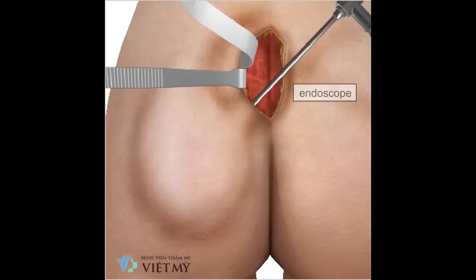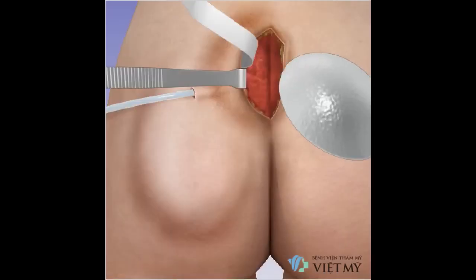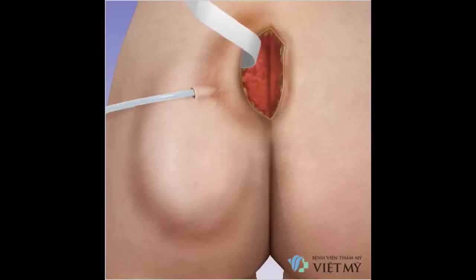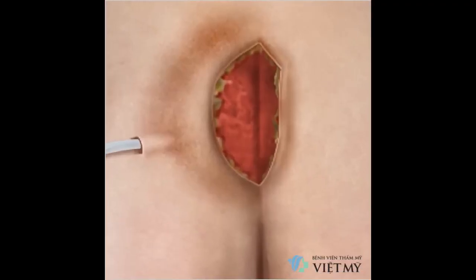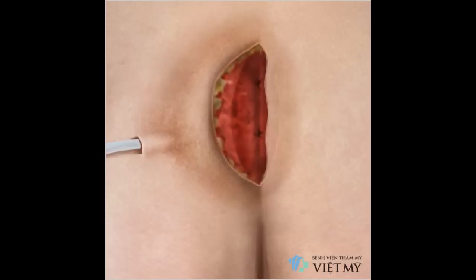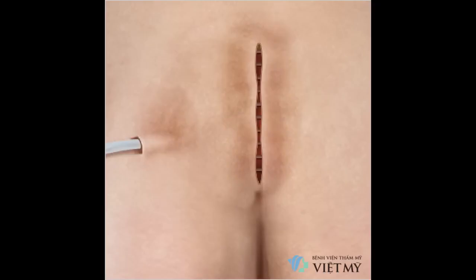Your physician may use an endoscope or fiber optic retractor to check for complete dissection. A drain, which allows fluid to exit your body as you heal, is put in place and the pocket is cleansed. Your physician will insert and carefully position a sterile implant, ensuring a tension-free fit inside the muscle. Once both implants are in place, your physician will verify that they look natural and symmetric. The openings to the pockets for each implant are sutured with dissolvable stitches. The openings used to access the sides of the buttocks under the skin are then sutured to the midline, and the incision in the intragluteal crease is closed. This incision may be sutured and/or sealed with adhesive.